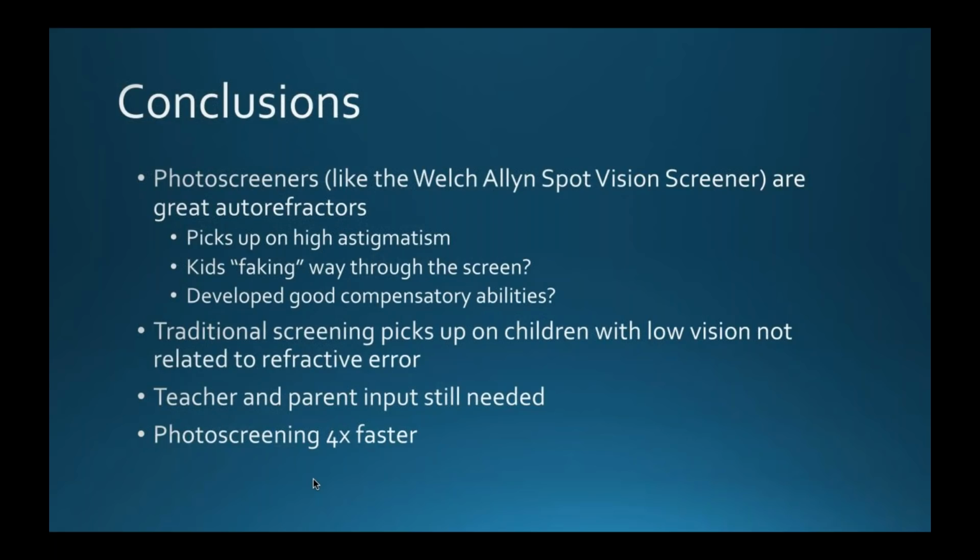Are kids faking their way through vision screens? Are they, like I said, utilizing any of those techniques to pass the test? Whereas a photo screener is an objective measurement, and so you can't fake an objective measurement.